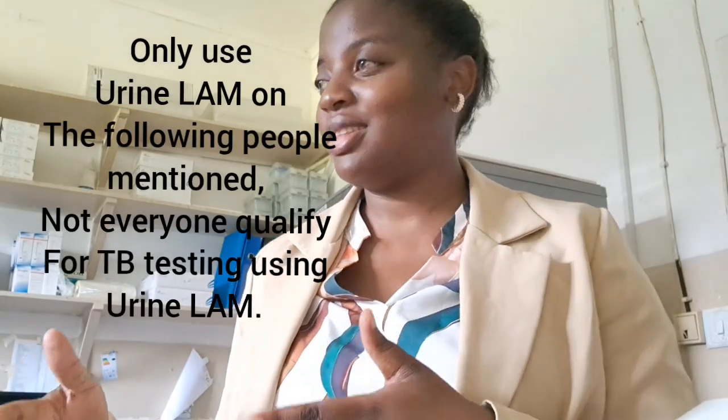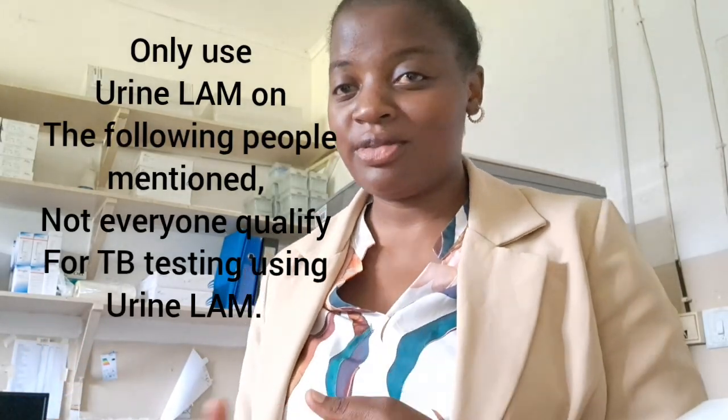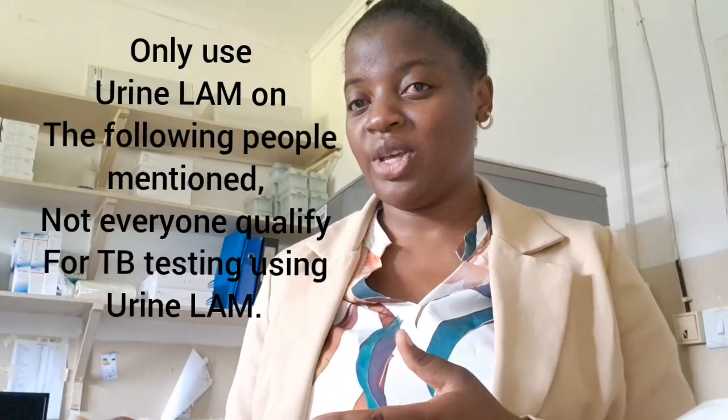So you may have a question to say, who are the people that qualify for the use of the urine LAM that we are about to do? So you can do this urine LAM on people who are on ART. You can do it on malnourished children, whether severe or moderate. You can also do it on those people that have chronic kidney diseases. You can do it on people with sepsis or those that are chronically ill, those that can't move around. You can use urine LAM if you feel like you want to detect for TB.